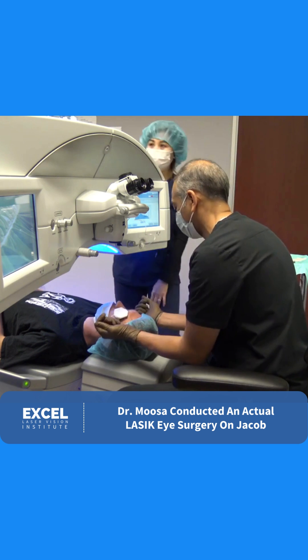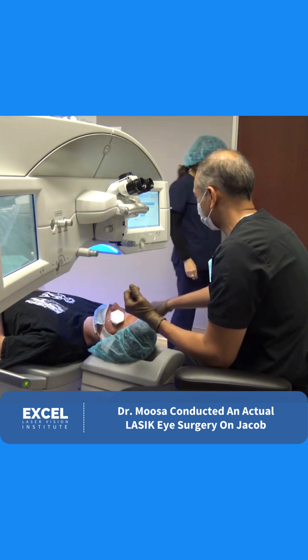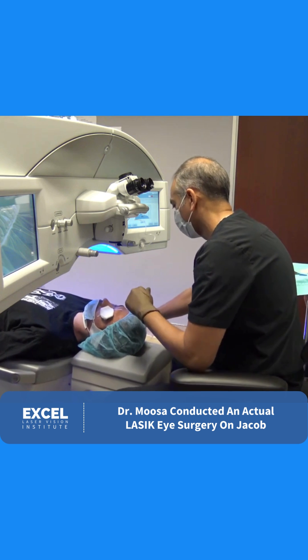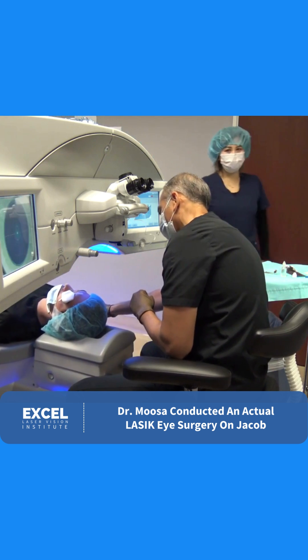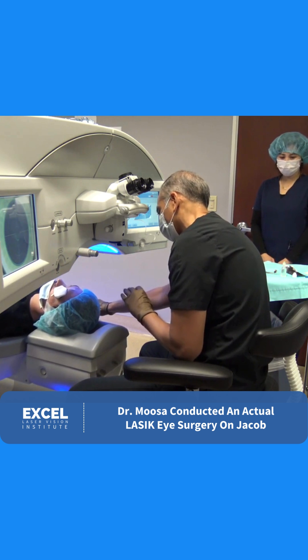So let me just give you a little bit of an understanding of what the experience is going to be like. I'm going to twist your head a tiny bit. It's a very comfortable process. The whole process goes by very quickly. The only thing I'm going to have you do is to find the green blinking light above you. Keep it in the center of your vision. When I tell you you're in perfect position, you don't have to make any adjustments even if the light feels like it moves at that point.